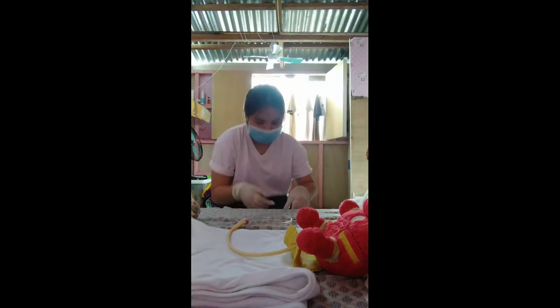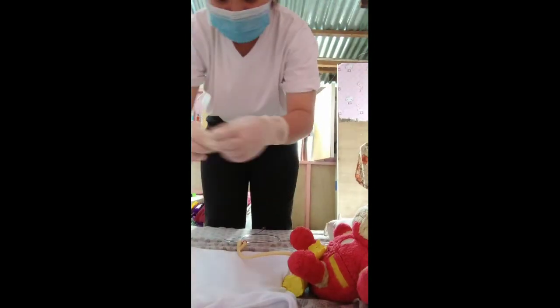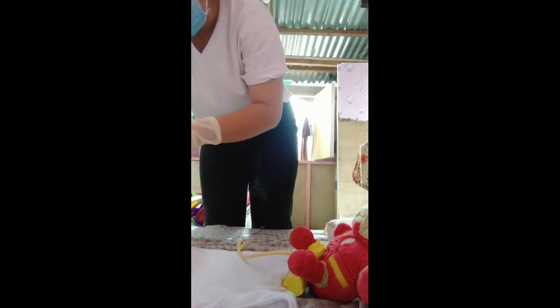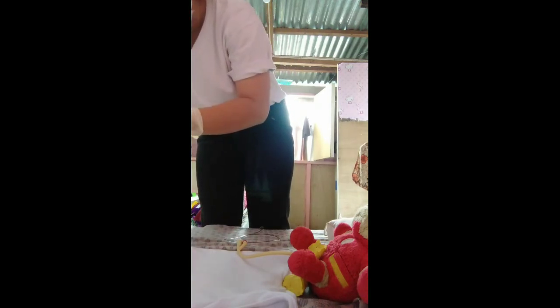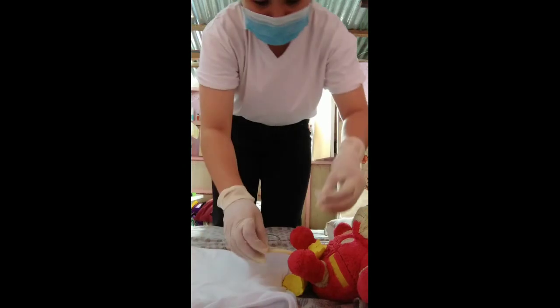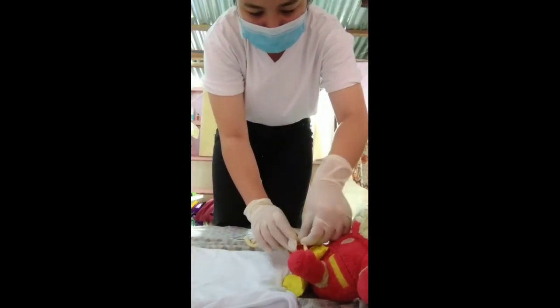Here, the urobag at the bedside of the patient, we need to assume that this is a stabilizer. We have a stabilizer. Put it here on the leg of the patient.